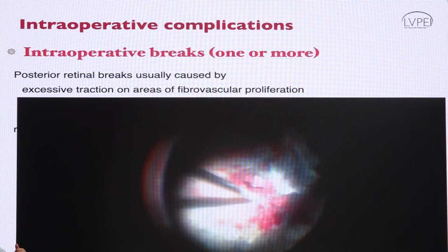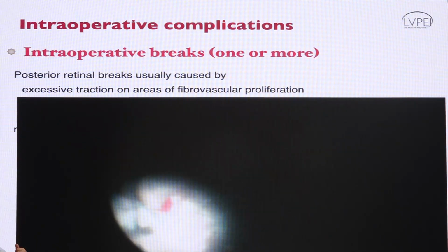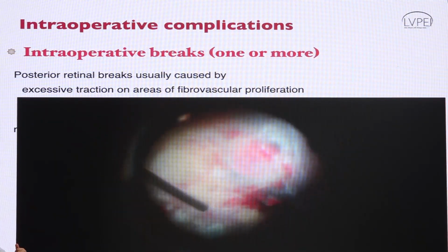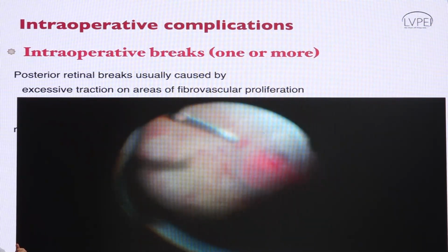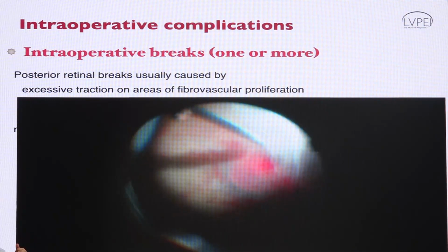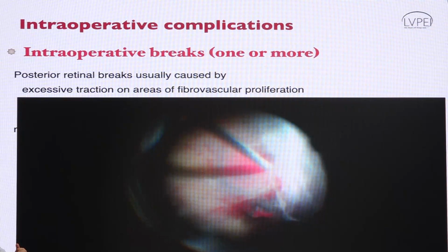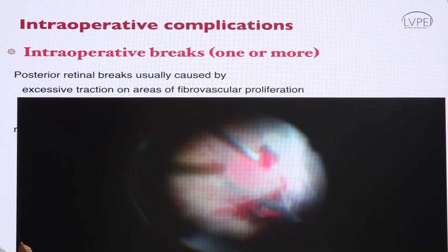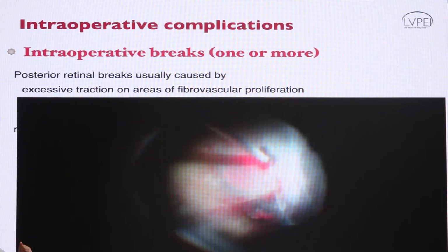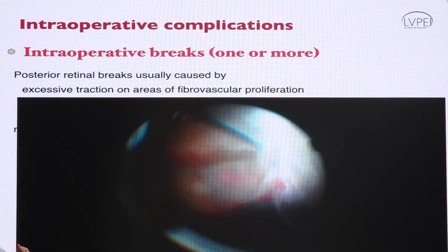So this is a diabetic vitrectomy being done, and this patient had a macular hole with some amount of traction around it. So that's the hole. And as this cutter trims the membrane, you see how the hole has got enlarged. There's a moment wherein the hole suddenly became double because the mouth of the cutter was not pointing in the right direction.